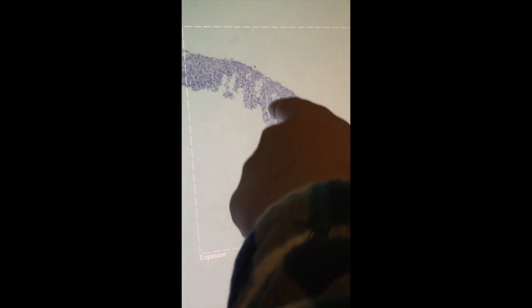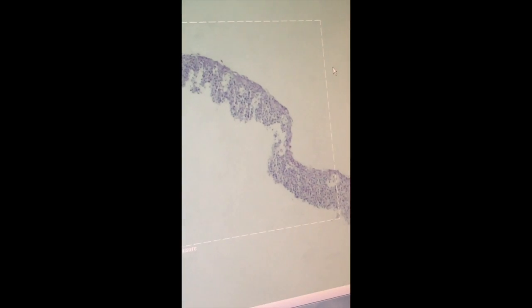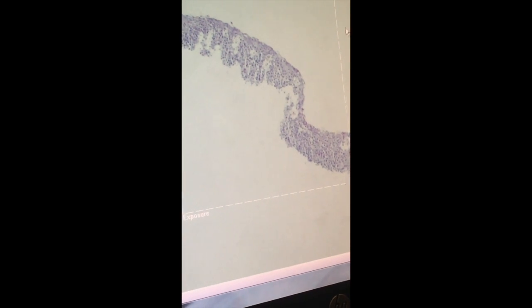So many dots. There are a lot of dots. Those are all cells. But what we're looking at is the biopsy as a whole. So do you see missing pieces like that have been torn away? Those white little hole things. Yes. And so those have been torn away because, again, that tissue is so fragile. Those cells have nothing to hold on to each other.